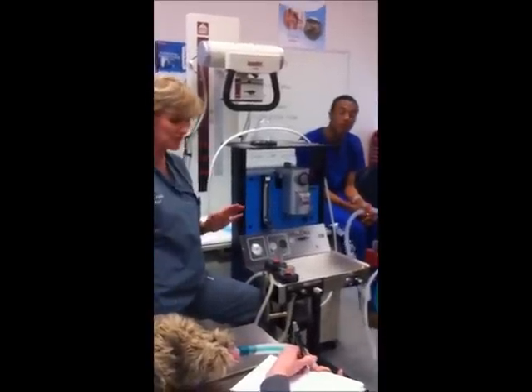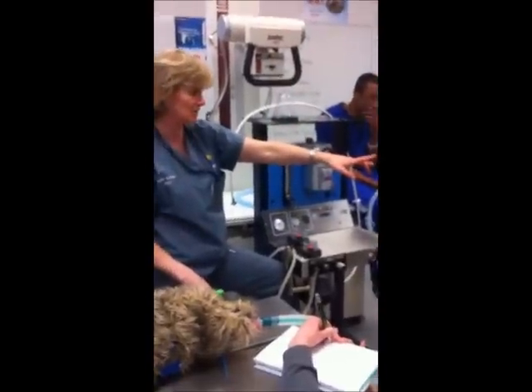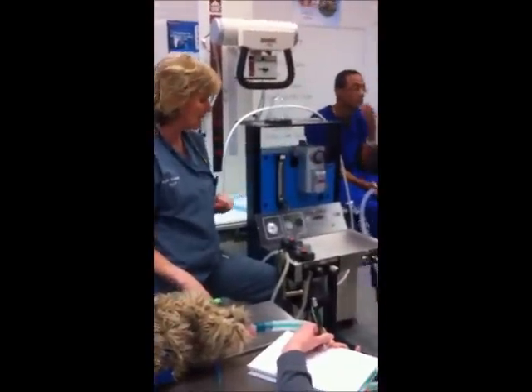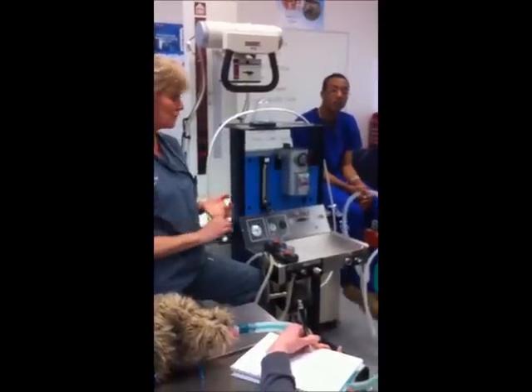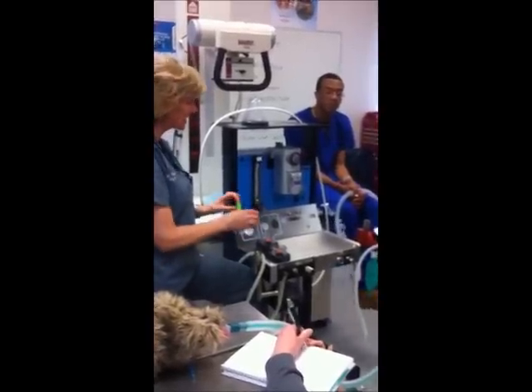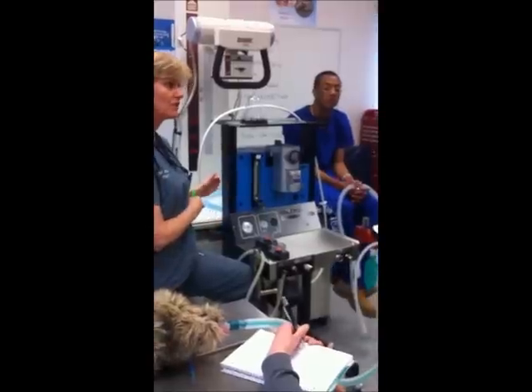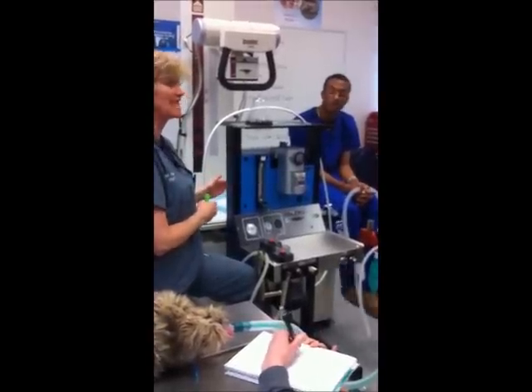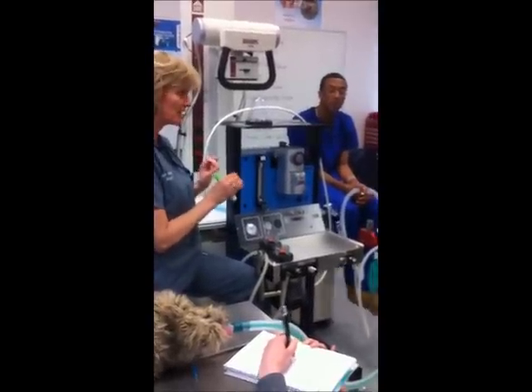There will be an animal. Probably, it might even be this animal set up, intubated like this one is on this table, and likely a cat on this one with a tube in. Set up that system. I want to make sure you know which system to choose and how to put it together correctly. The order of how you hook things up in terms of setting up the circuitry is not important to me. Because the anesthetic machine, for the most part, when I set up an anesthetic machine, is not running yet. So as long as you get everything hooked up properly, that's fine.